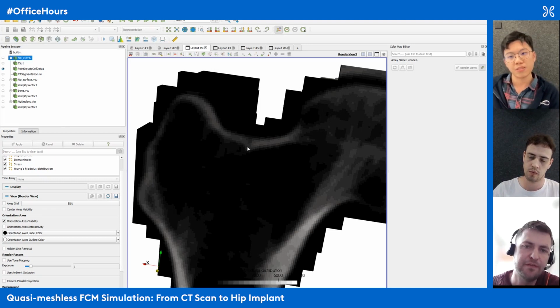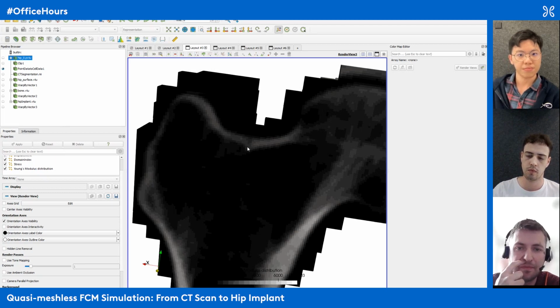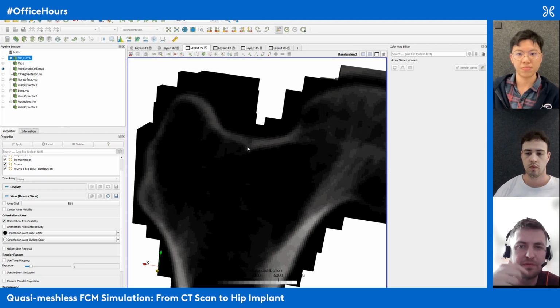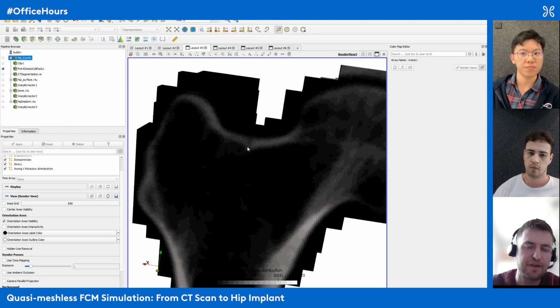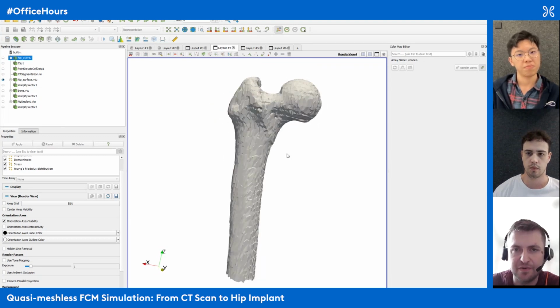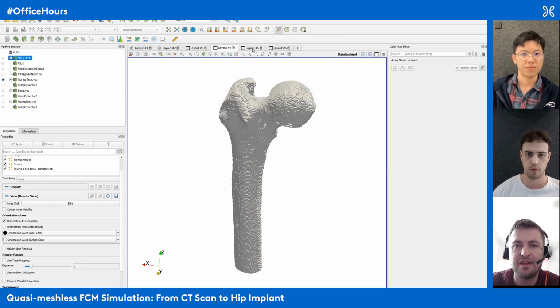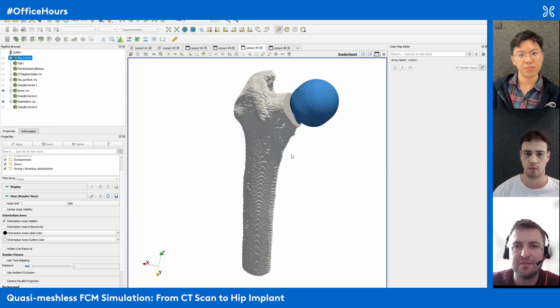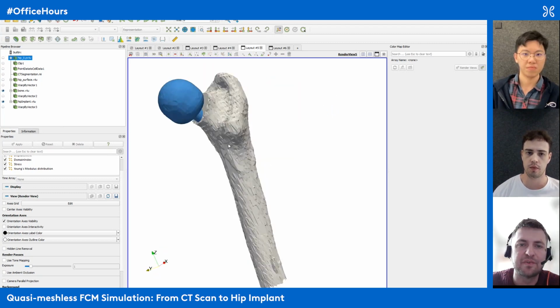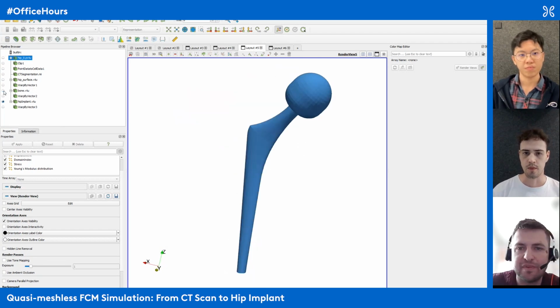So if we stay with this example, one pretty direct consequence of being able to do computations like this is this: what if this bone is not strong enough anymore and we want to fix it? We probably will need an implant. So you could say, all right, why don't we try to put an implant inside and see. Here you see, for example, part of that bone was cut off and an implant was inserted. I'm going to make this bone disappear for a second.